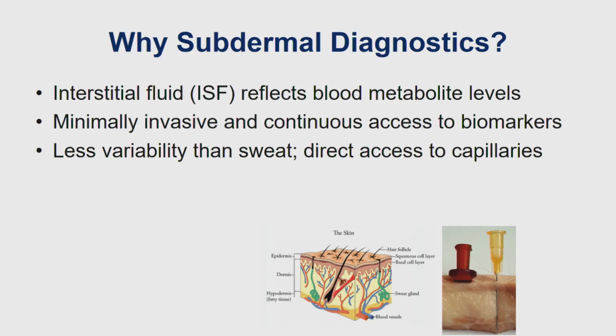The skin interstitial fluid can be accessed in a minimally invasive manner, as can be seen from this particular image. I'm showing you this image again, but I think this is the best representation to show you the difference between a hypodermic needle and a microneedle. And we'll also explain why we do not want to use the term microneedles, because if you say microneedles, people think of needles, and then they imagine this kind of needle here. But when you say subdermal wearable device, which has projections or microspikes, which was a term that we introduced initially, then it's much more acceptable.